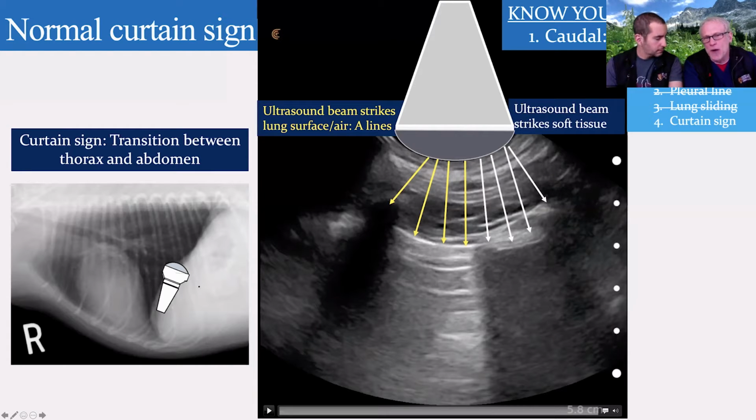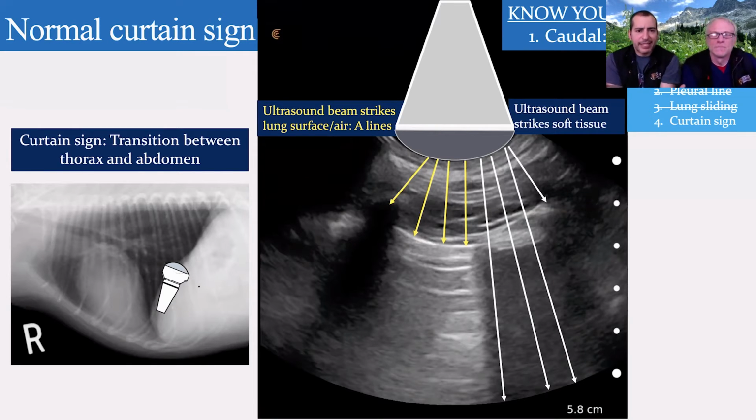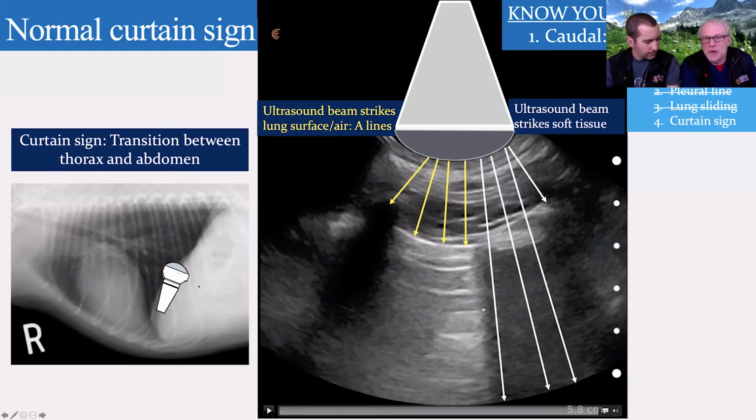We put the ultrasound beams come down. What have I hit right there, Dr. Chalhoub? Well, you're going to hit bone again, Dr. Boysen. So you're going to get rib shadow. Absolutely. And here, Dr. Chalhoub, I come down. I'm going through the soft tissues. What do I hit? Well, now you're going through soft tissue to soft tissue to soft tissue. And all of a sudden, this is making sense to me again. I'm seeing structures again, Dr. Boysen. Absolutely. So half of this image is covered with artifacts and I can't see anything.